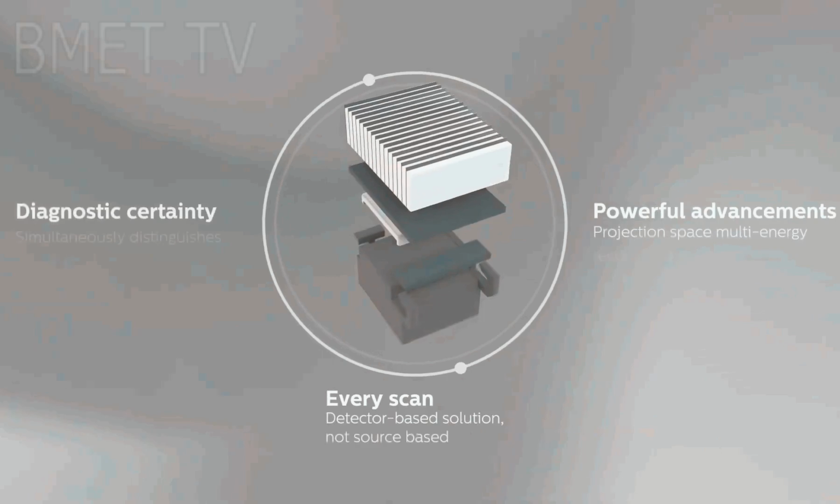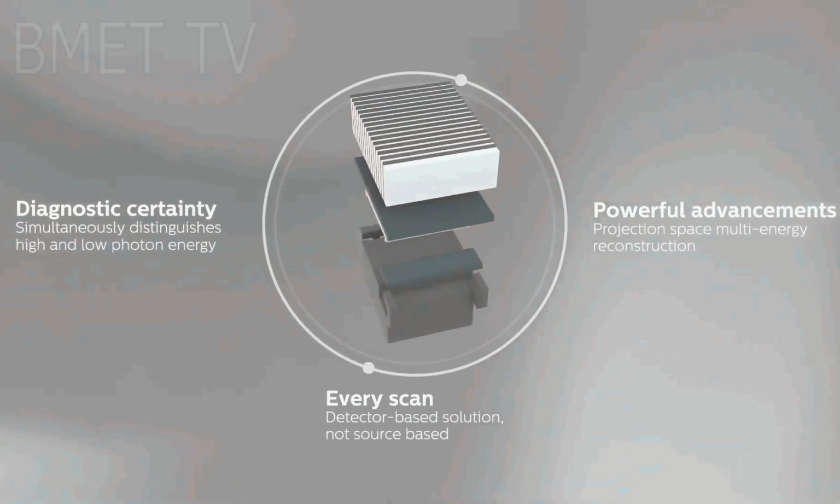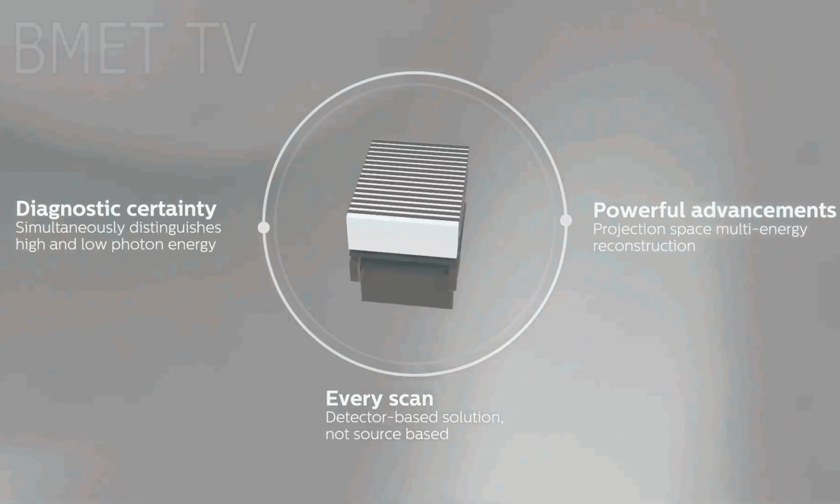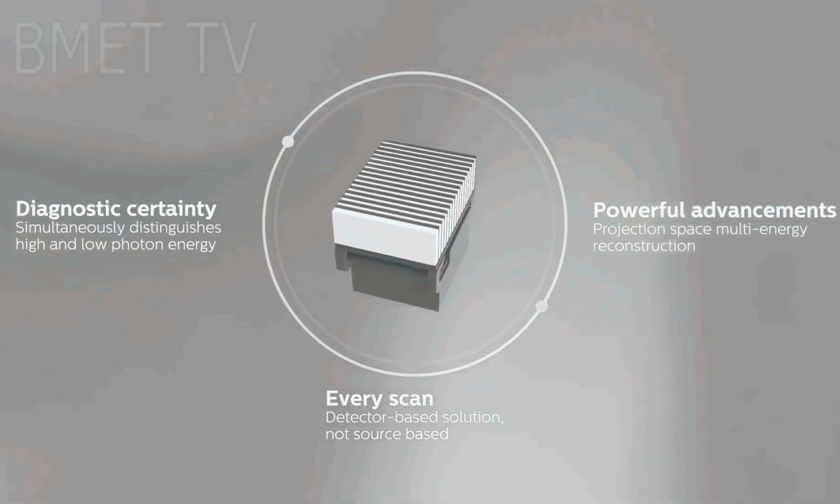A disadvantage of xenon gas is that it must be kept under pressure to a certain extent. Loss of X-ray photons in the casing window and the space taken up by the plates are the major factors hampering detector efficiency.